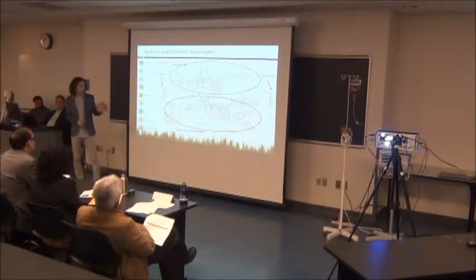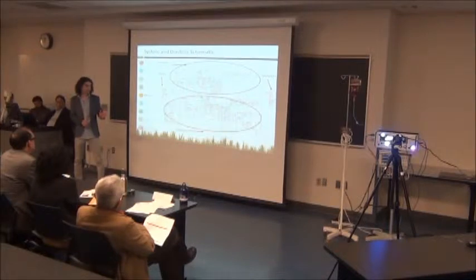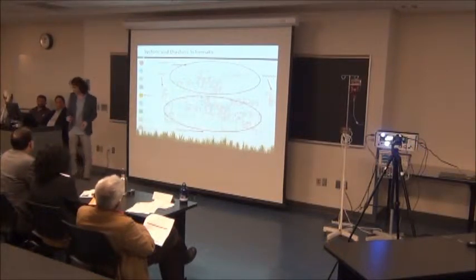Now, we use the same circuit for the diastolic pressure, but we had to do some technique. First of all, we had to invert the signal, raise it up by 2 volts, and then pass it through the same circuit as the systole, and then subtract the output again by 2 volts.